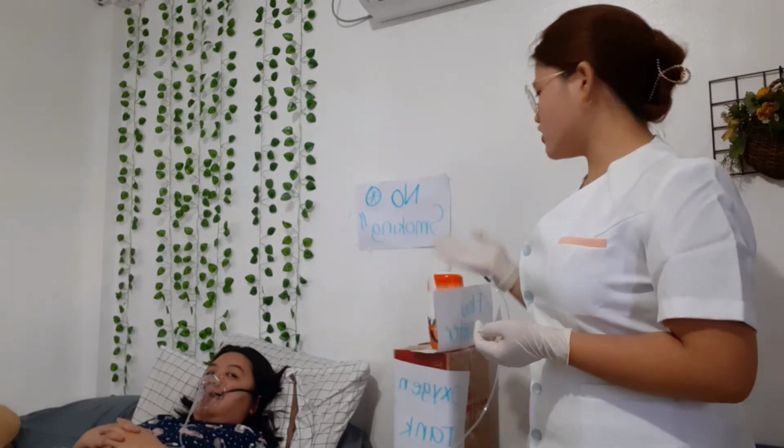So next, you're going to regularly check the level of water in the humidifier. You need to fill or refill with water as needed. So the rationale for that, it is to provide continuous humidification and prevent dryness of mucous membranes. Then next, you need to wean the patient from oxygen as soon as possible using the standard protocols. So the reason for that, it is in order to prevent the patient from becoming dependent on the therapy.